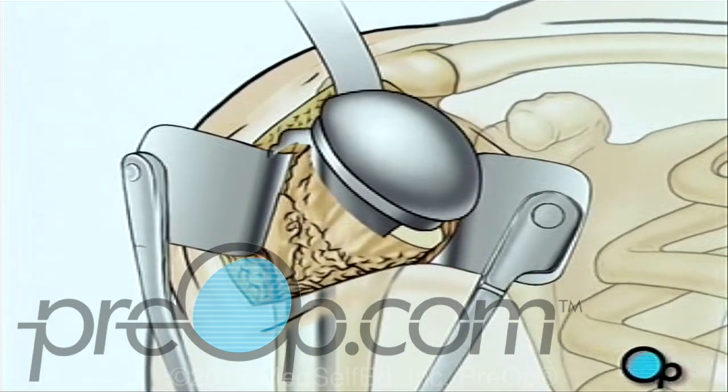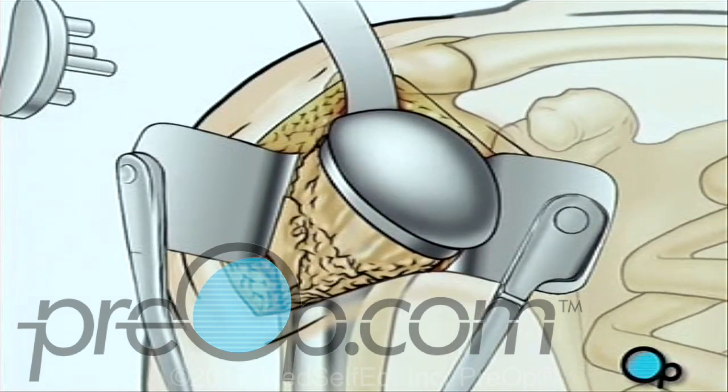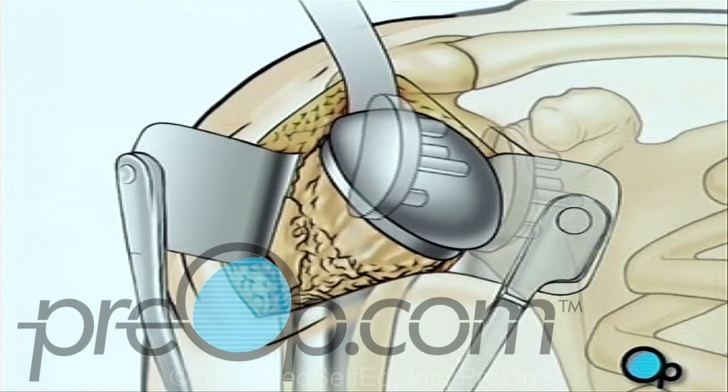Next, your doctor will smooth the inner surface of the shoulder socket. Once the socket has been thoroughly cleaned, the artificial lining will be secured in place.